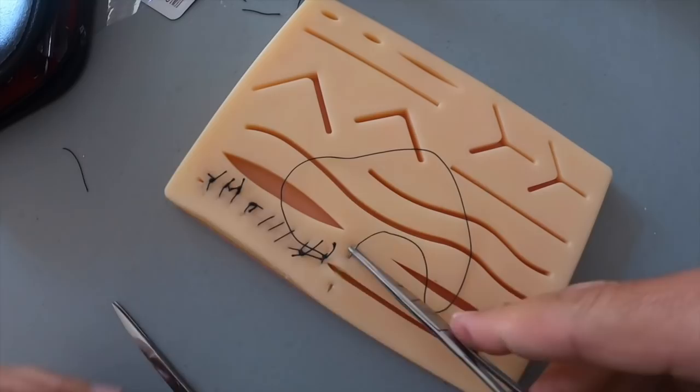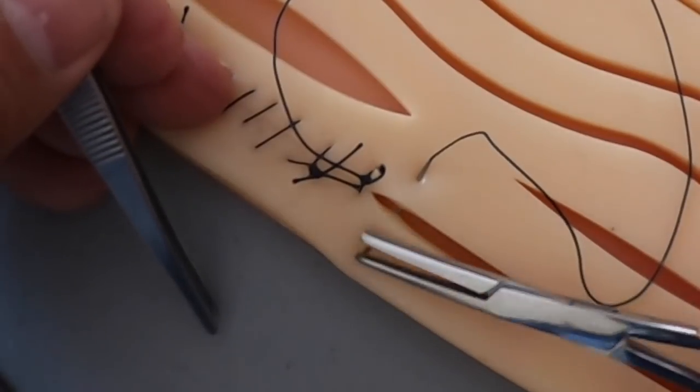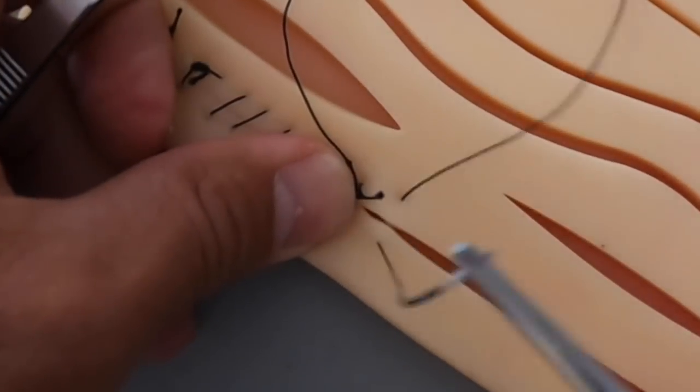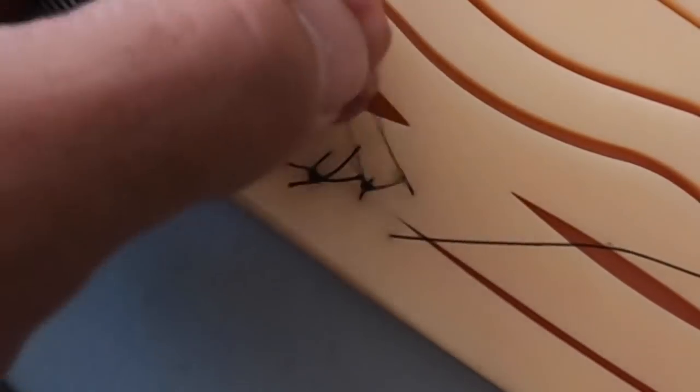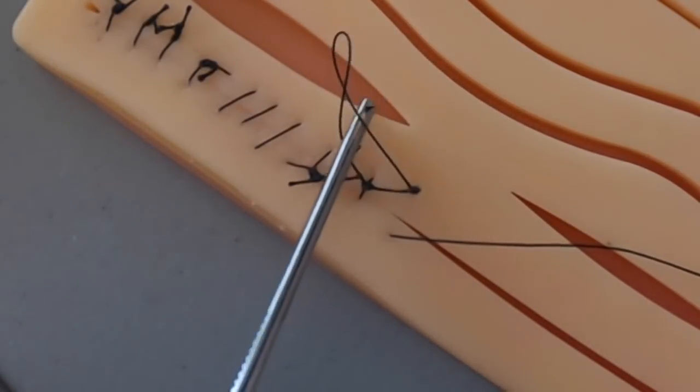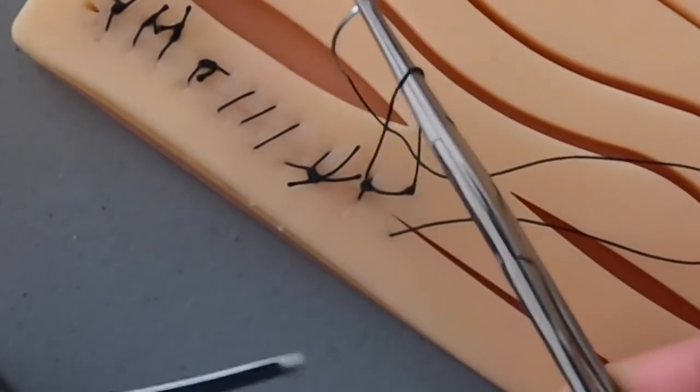All right, this time instead of just going to the next one, you see how it forms a loop right here? So you're going to go through that loop.